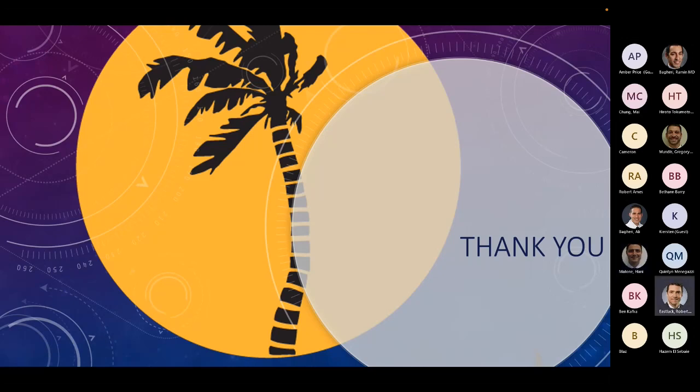I'm not sure there's any evidence that with ALIFs you actually get helpful information. Most of the time, you get a delay in the neural function drop. It's not something you get in real time. Anybody else have a different take on that? In other words, it doesn't really help you intraoperatively.